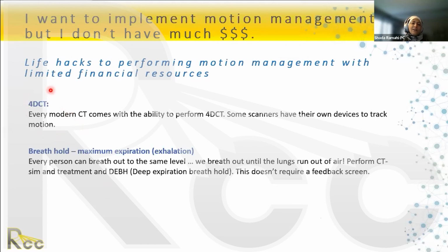4D CT, definitely everyone can do a 10-phase 4D CT on any CT simulator. And then at least you have evidence of the motion of the patient's tumor. If it's 5 millimeter or less, you can use the guidelines for SBRT.